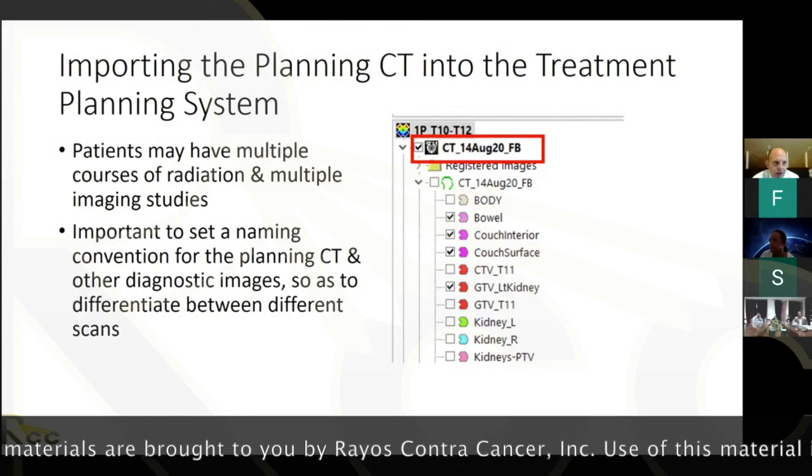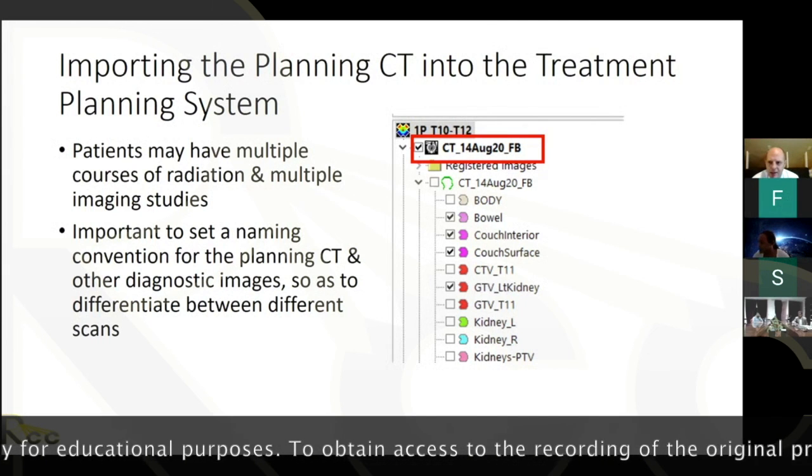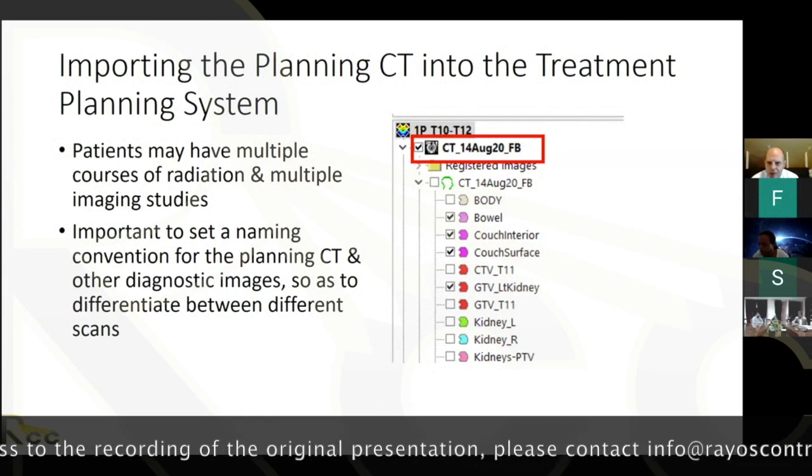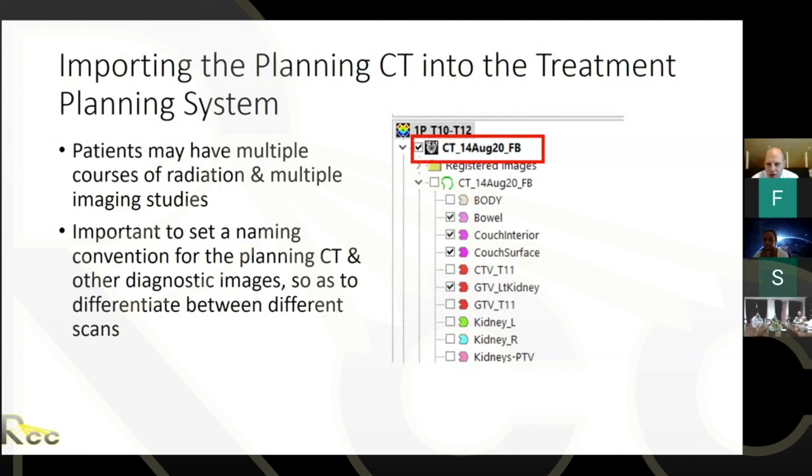It's a good question, actually, and I kind of brushed over it because we don't typically use it here, but it's a very useful tool. The big benefit of surface-guided is that it's non-ionizing, so it's kind of free information. Usually the way that works is either at the CT or at the first fraction, you acquire some sort of contour, maybe at the first fraction after you set up, or based on the CT. Then you can verify each day that the contours are aligned, or use that information for your alignment. It's a way to do that without any ionizing radiation. As far as planning goes, it doesn't really factor too much into the planning process. It's more of the image guidance process at the machine.